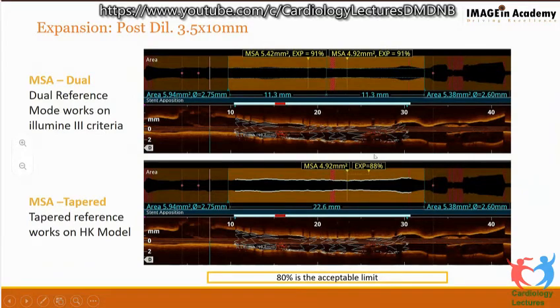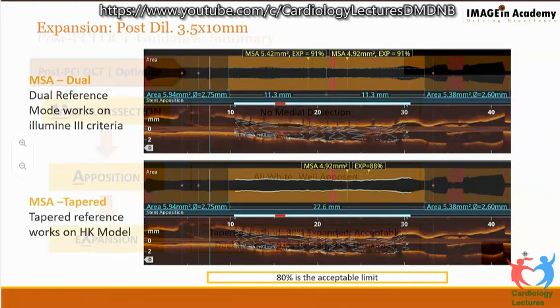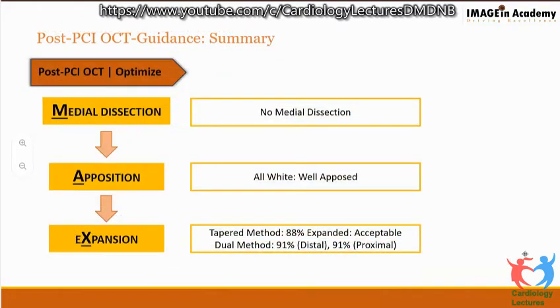On post-dilatation, in both the dual as well as in the tapered, this cell expanded and appears to be 80%. Now, what you see here is probably linked to the blood swirls, which are the red thing. We'll show you some more case examples, but the stent is well expanded. So we've got no dissection. We have a well apposed, well expanded stent. It's 88% by the tapered method and 91% by the dual method.